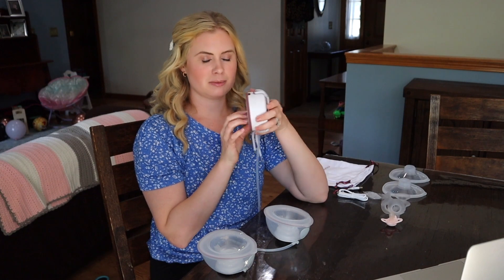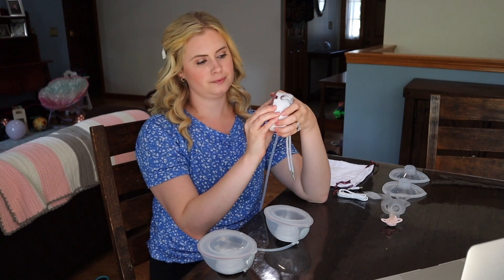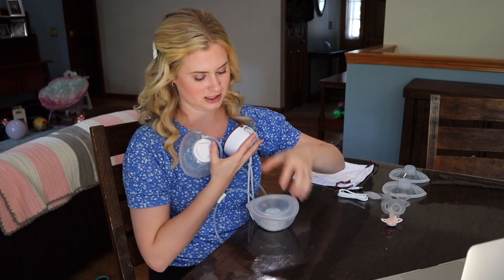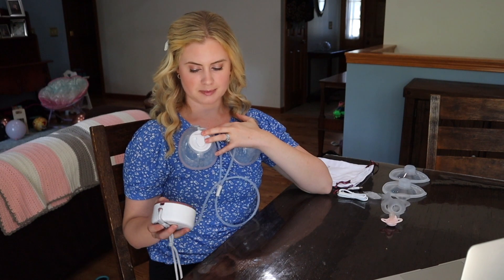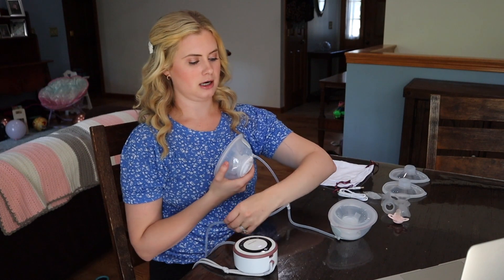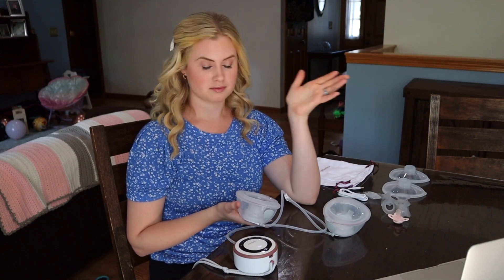I will say this pump is not the quietest — I'm going to go ahead and play it for you. Even against me like this, it is not the quietest pump, so keep that in mind when choosing. I mainly use wearable pumps for hands-free freedom more than trying to subtly pump in public. But it's still great for pumping at home, in the passenger seat, or at work without having to undress.